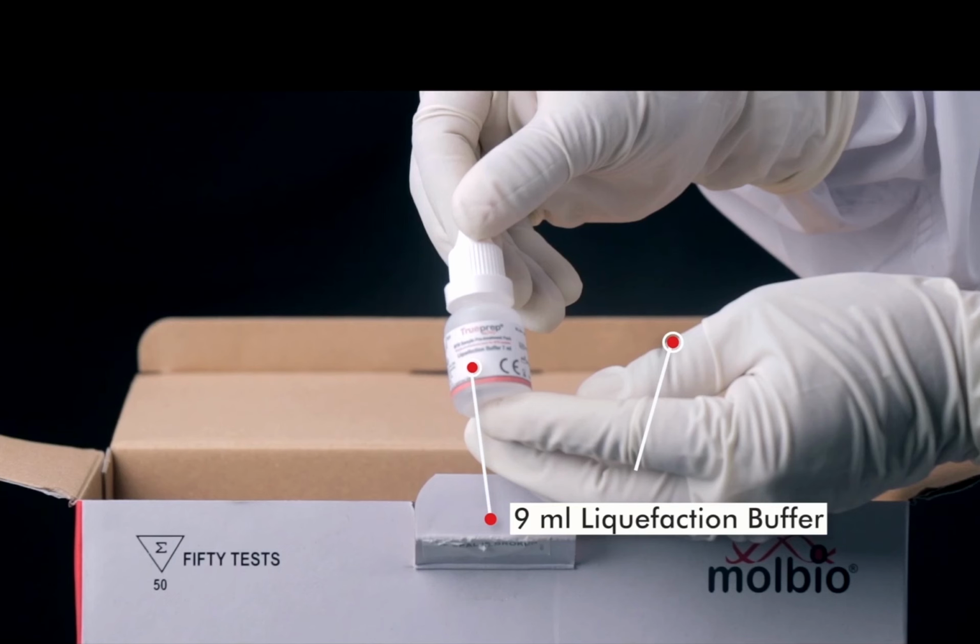So what does it do? As the name suggests, liquefaction. As you know, most sputum samples are viscous and mucopurulent, a little thick, isn't it? If the TB bacteria is stuck inside, we cannot get the DNA out of it. So first, the entire sample has to be liquefied, it has to become liquid. That is what this liquefaction buffer does.